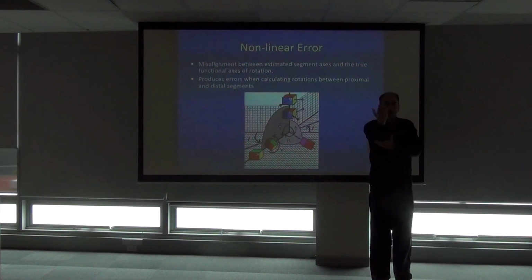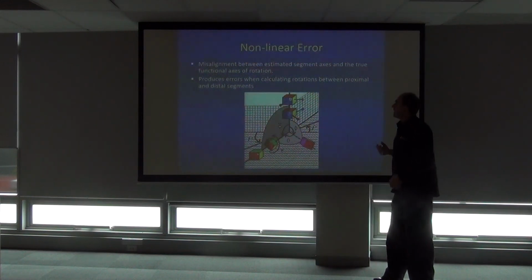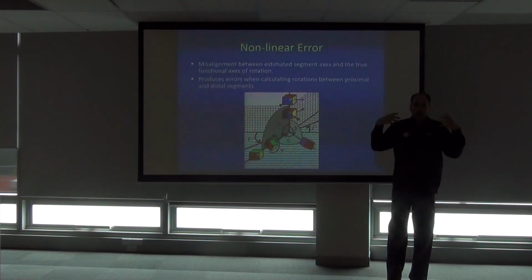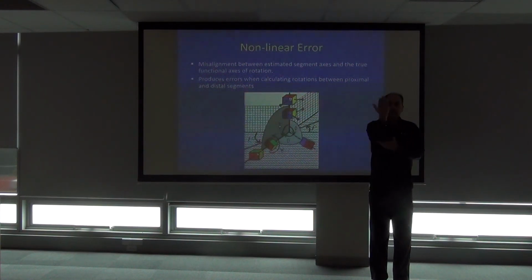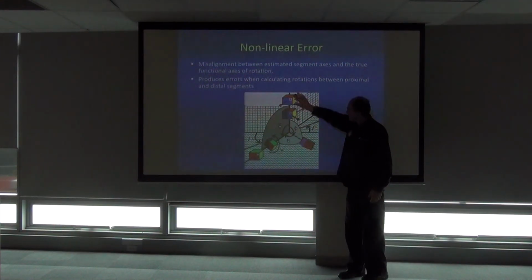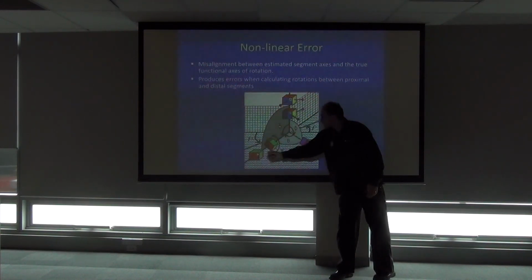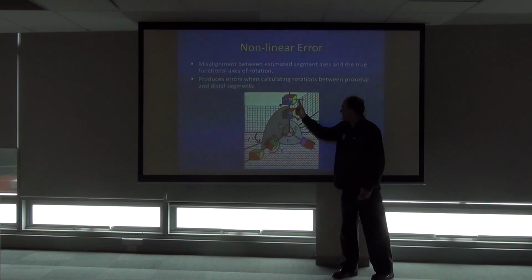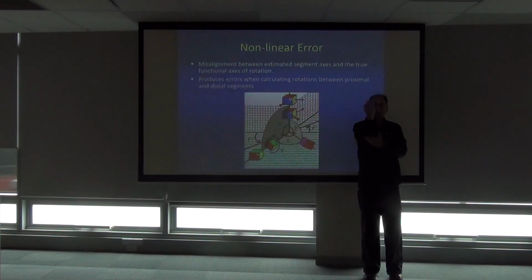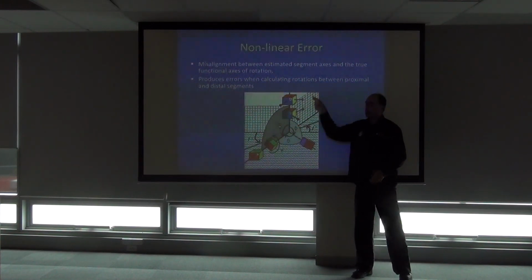So if I'm going like this, we've got a true axis, my hand's just going from there to there and back up again, flexion extension, more or less. Okay, if we have a misalignment of axes that we're doing our rotations around, something else is going on. Instead of going from here, start to finish, so here's our start, that cube up there has been rotated and gone straight down here, so red there, now it's on here, the blue is now underneath and the yellow stays on this side. So it's just a straight rotation about an x-axis here, purple.